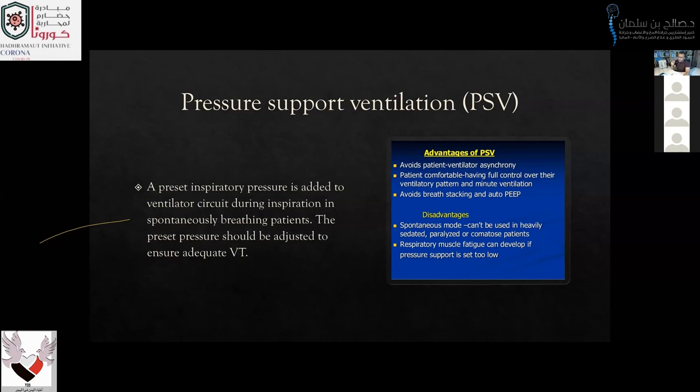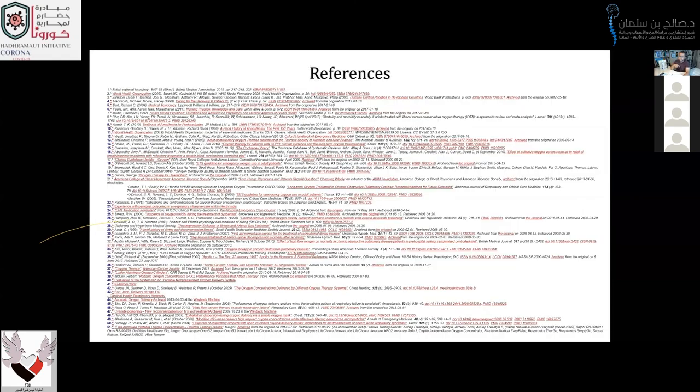The disadvantage is that this spontaneous mode can't be used in heavily sedated, paralyzed, or comatose patients. Respiratory muscle fatigue can develop if the pressure support is set too low.